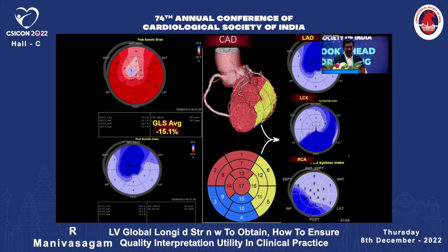Showing the middle as the apex. The center is the apex, you know. Exactly. The center is the apex, and then on the top this is the mid area, this is the basal area. So you're taking the ventricle and squashing it, so the apex comes in the center.